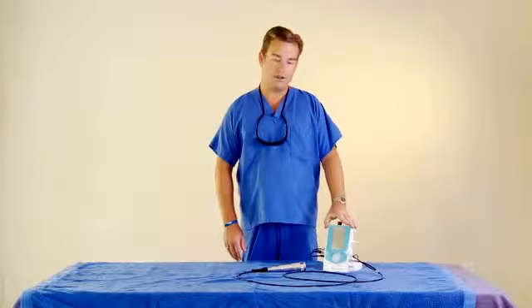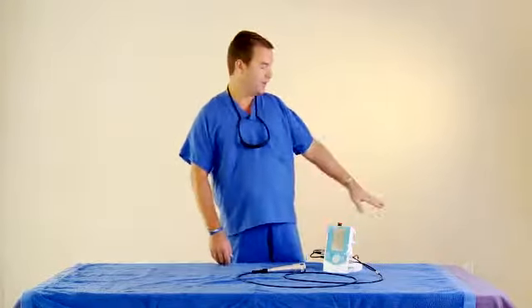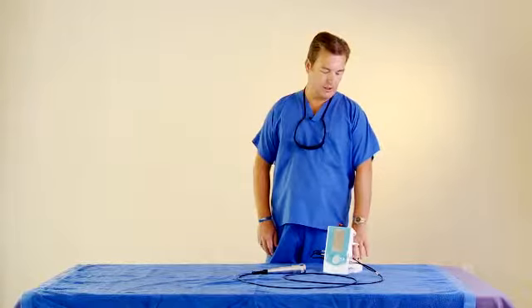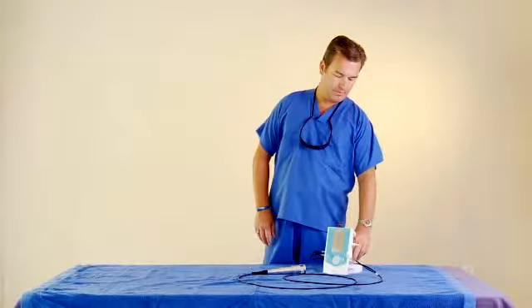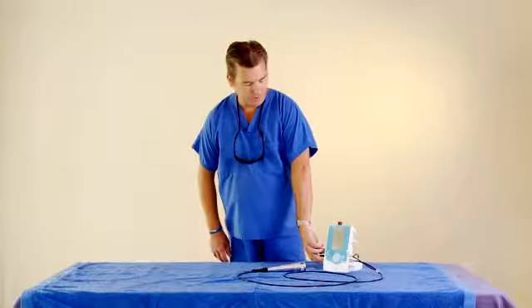The laser is already set up. We already have it plugged in to the AC. You have an AC adapter that's plugged into the wall. You can also run this off of battery power. It's a 22-watt battery. And for safety and setup, please see your manual.